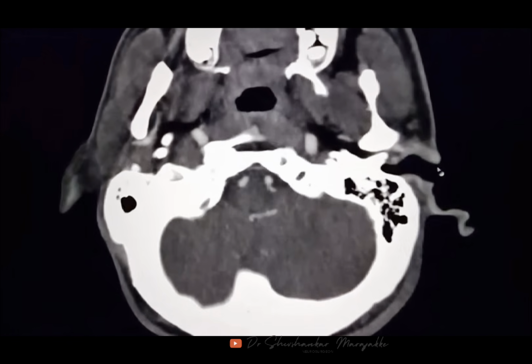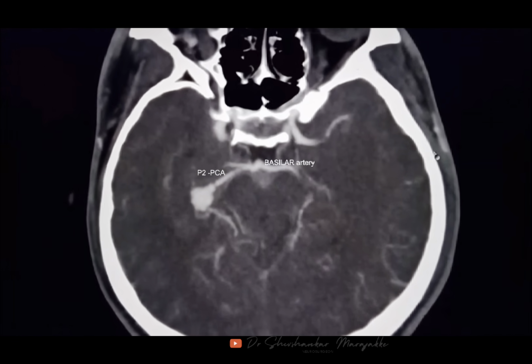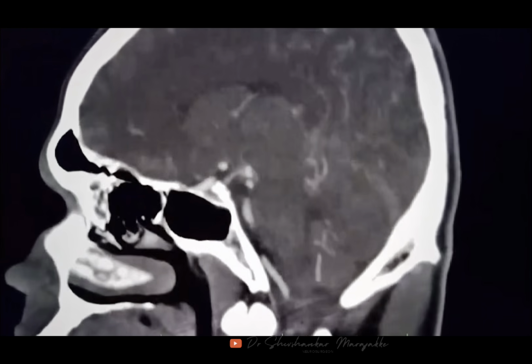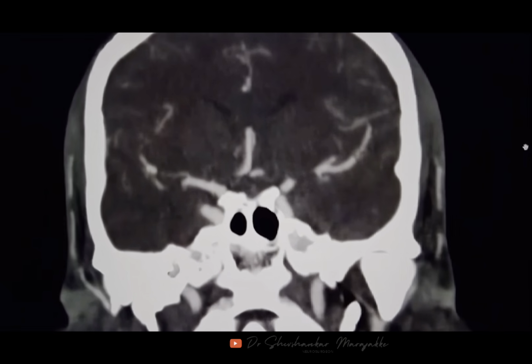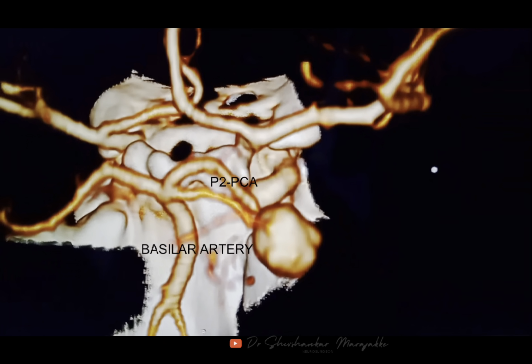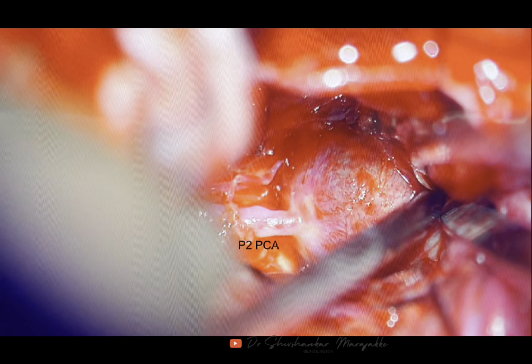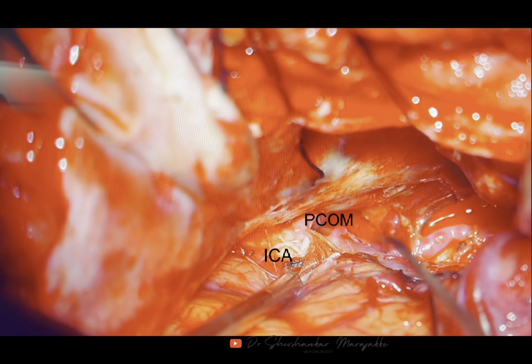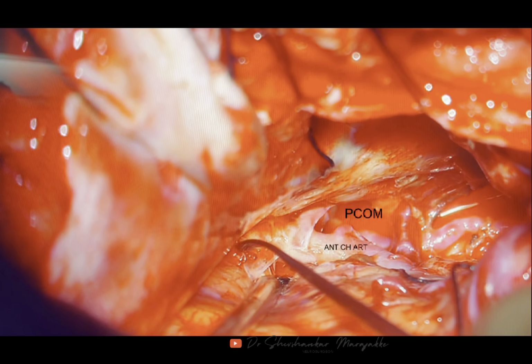Micro-anastomosis of intracranial arteries remains an important procedure which can save the patient's brain from ischemic complications by intentional or accidental occlusion or injury of the parent artery during intracranial aneurysm surgery or tumor surgery. So sometimes we leave a small bit of tumor around the vessels in fear of injuring the vessels. So when you have mastered such techniques, you go ahead and resect because you can handle the complications if they happen. So sometimes the fear stops us from going further and achieving complete excision. So therefore I believe the future of bypass surgery looks bright.